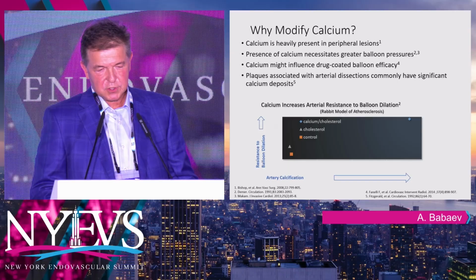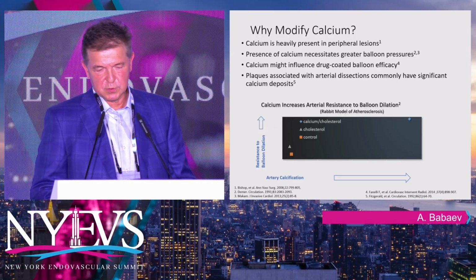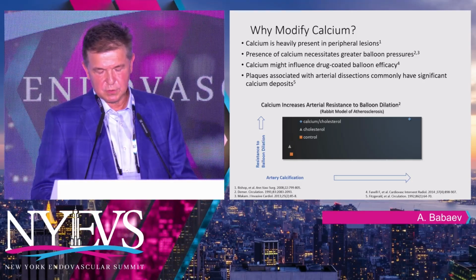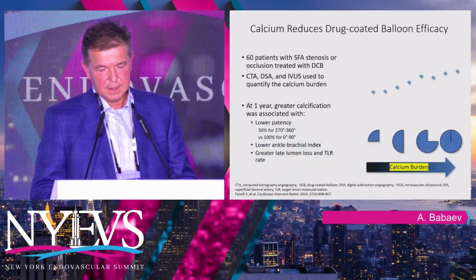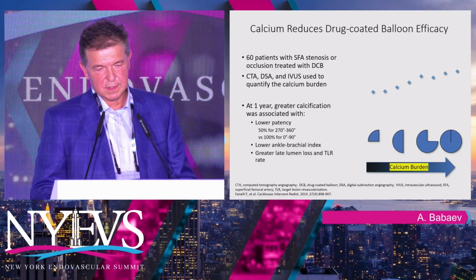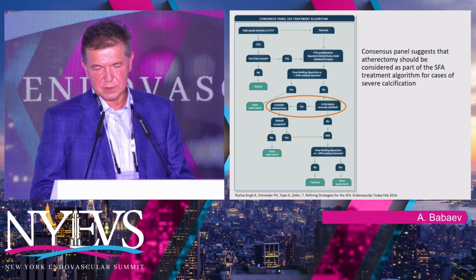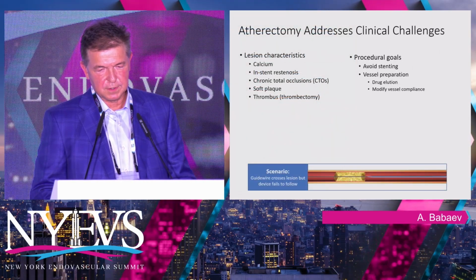So why modify calcium? We know that the presence of calcium necessitates greater balloon pressures, and calcium might influence drug-coated balloon efficacy. If you try to dilate a calcified lesion without proper preparation, it may lead to severe dissections. Dr. Fanelli already presented data showing that calcium reduces drug-coated balloon efficacy, and the consensus panel suggests that atherectomy should be considered as part of the SFA treatment algorithm for cases of severe calcification.